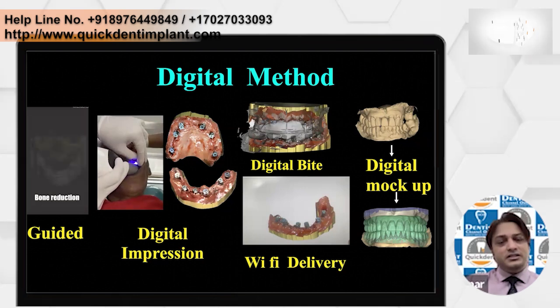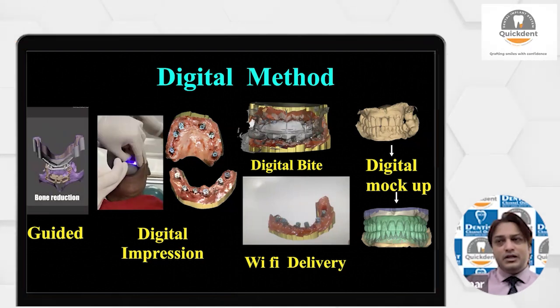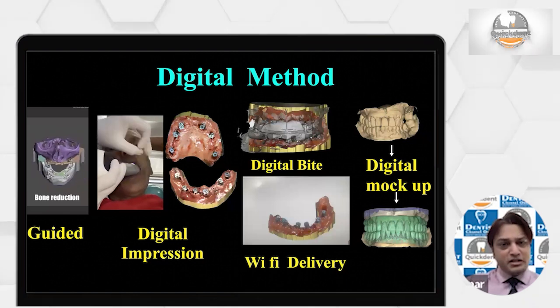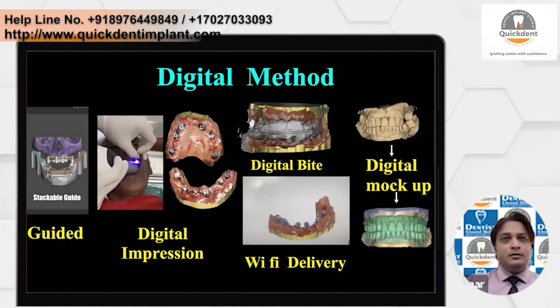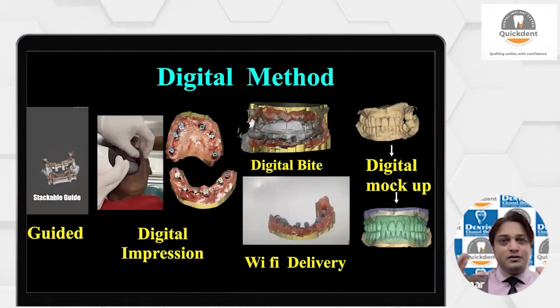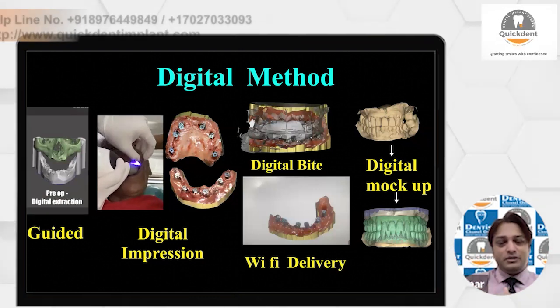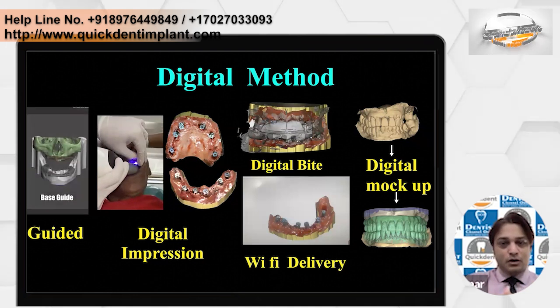Then the second aspect is digital impression, because it is hassle free. It takes decently less time with the new, advanced scanners. And the best part is, you don't have to put a big tray into the patient's mouth, and after surgery the patient is already uncomfortable. So this also helps us a lot.